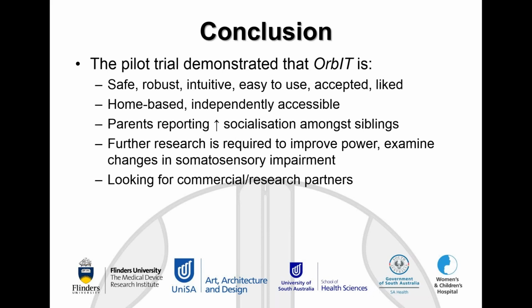So we identified it as being safe and robust, very intuitive, easy to use, well liked and accepted. It demonstrated that it was a home-based solution, so they didn't need to come into a clinic or to the hospital. We could just deploy it to the home, and we made sure that it was independently accessible, picking up on the universal design philosophy that these children, when they wanted to game, they could just go and do it themselves and weren't relying on others to set it up for them.